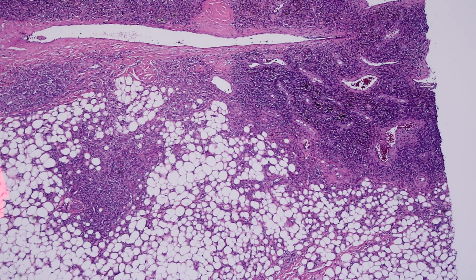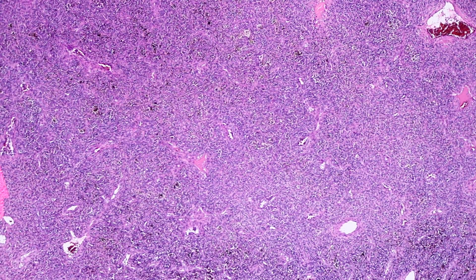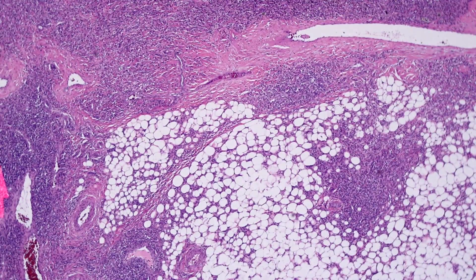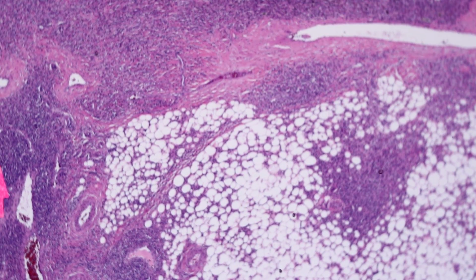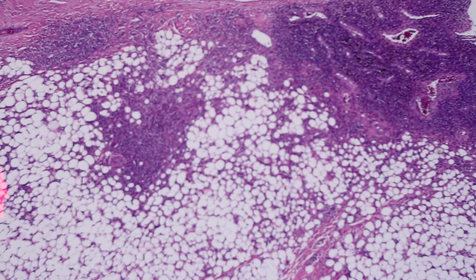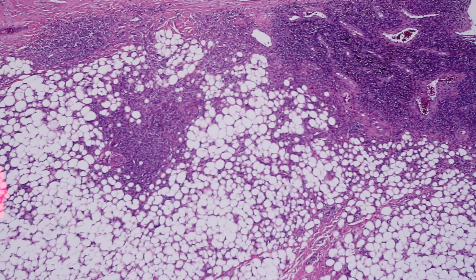It just sends little feet down into the subcutis, but the bulk of the tumor is clearly not replacing fat. It's pushing everything out of the way, and just at the edges trickling into the adjacent structures, whether it be dermis or subcutaneous adipose tissue. So don't be worried. This feature by itself is not at all concerning to me in this context for DFSP, and it is actually a common finding to see this form of fat involvement in dermatofibromas, particularly the big ones.